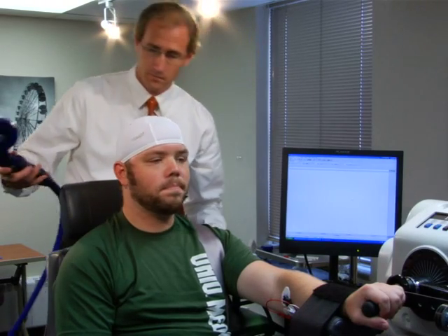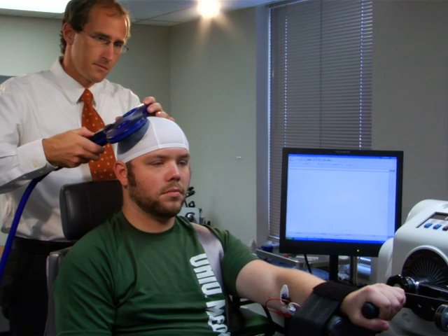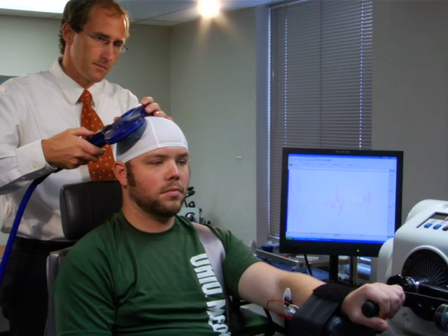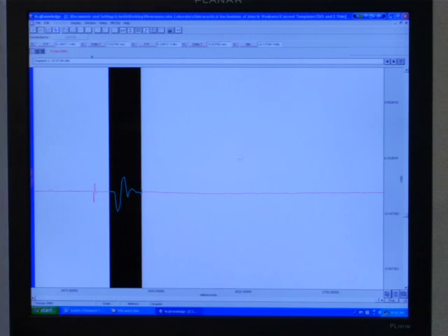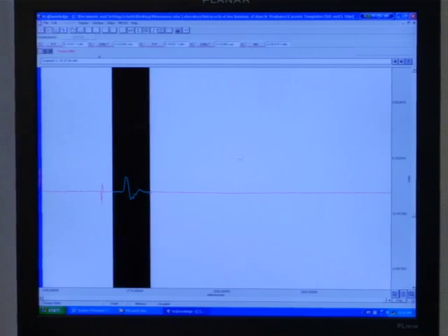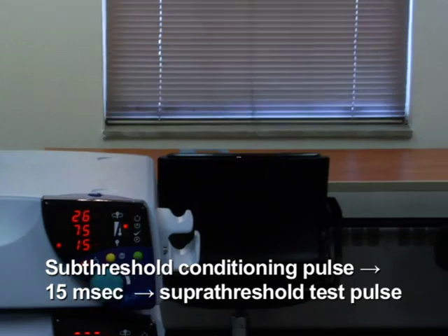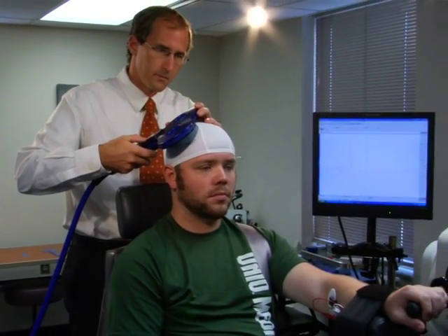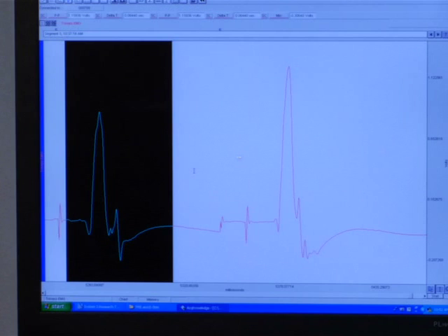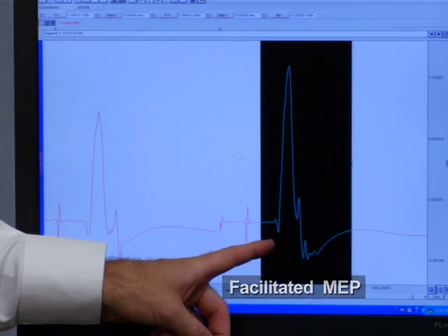To quantify the FCR corticospinal silent period, deliver a single TMS pulse to the hotspot at an intensity equal to 130% of motor threshold while the study participant is performing a wrist flexion muscle contraction at 15% of maximal strength. To determine intracortical facilitation using paired pulse TMS for the FCR muscle, first determine the stimulus intensity needed to elicit a motor evoked potential between 0.5 to 1 millivolt. Next, deliver a subthreshold conditioning pulse at 70% of motor threshold, 15 milliseconds before a suprathreshold test pulse. A conditioning pulse delivered at this time period will increase or facilitate the amplitude of the motor evoked potential more than a single unconditioned pulse of the same intensity.